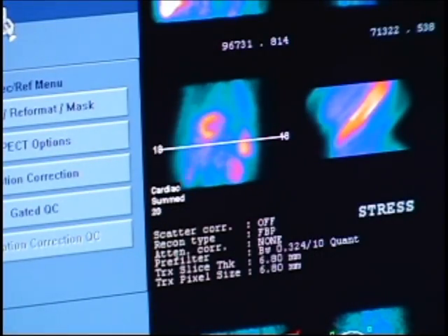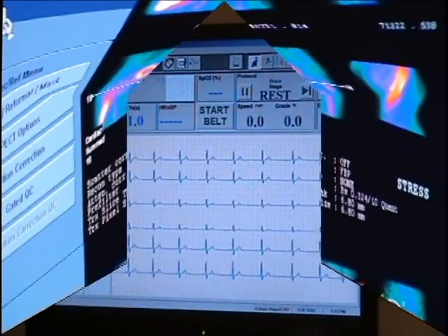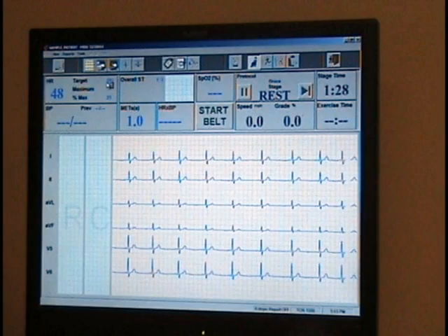Once the resting images are complete, electrodes will be placed on your chest so that we may monitor your heart during the stress portion of the test.